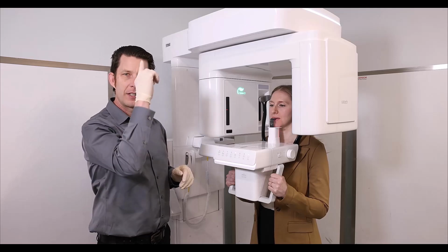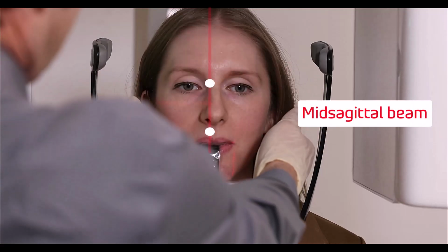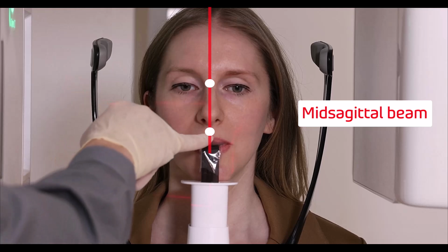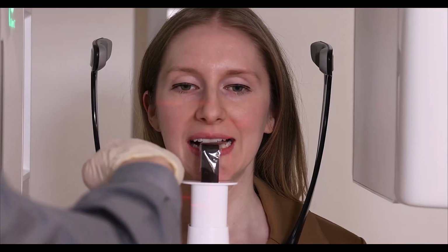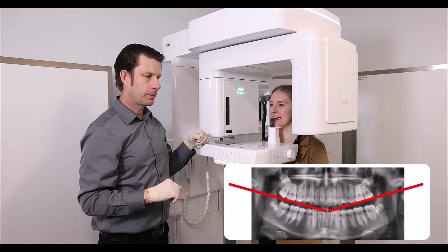First, we're going to look at our mid-sagittal beam. Make sure it's lined up right between the eyes and right through the philtrum. And I can do that by gently moving their head left to right, getting that line lined up right through the center of the eyes and right through the philtrum. After that, I'm going to have my patient smile really big for me, and I'm looking at their maxillary occlusion to make sure it's slightly tipped down about 10 degrees.